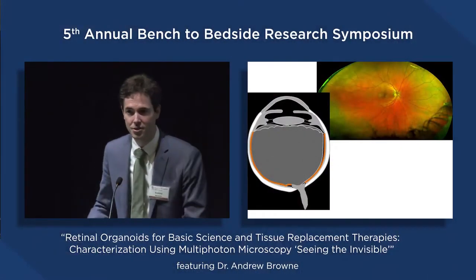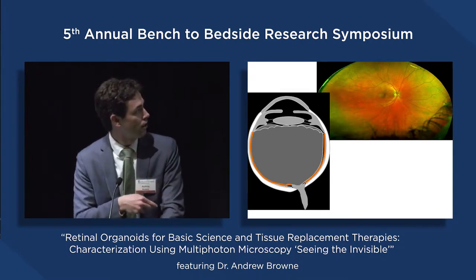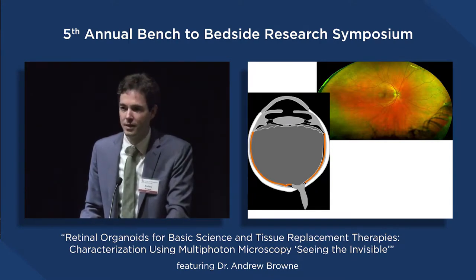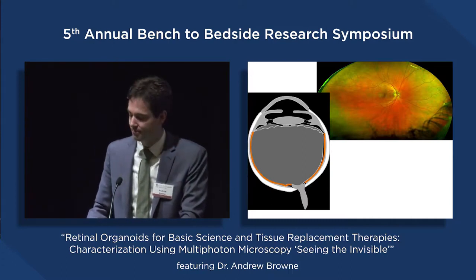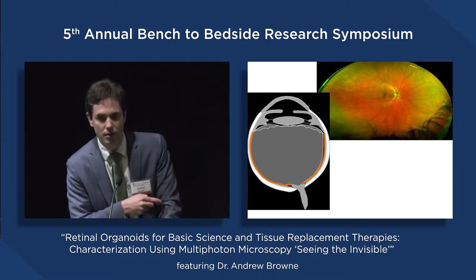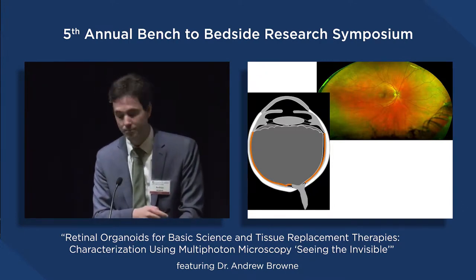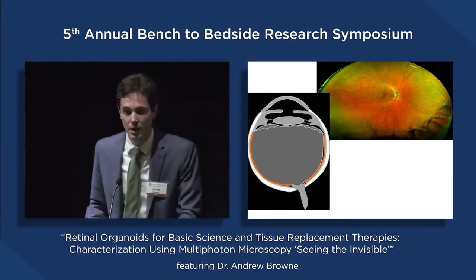So we've seen some cross-sections of eyes today, and we see in this depiction here the orange retina, the most important tissue in the body. And when we take a photograph inside the eye, we can see that important tissue. This is where light's turned into electricity and allows us to perceive every single bit of visual information. And so in this picture, we can see the optic nerve, we can see the blood vessels coming off that nerve, we can see this little change in pigment centrally. That's your central vision. That's where you read and see faces. That's what gives us our high acuity vision. And then, of course, everything else over here is the peripheral retina, the peripheral vision. That's what saves you from being hit by a car.